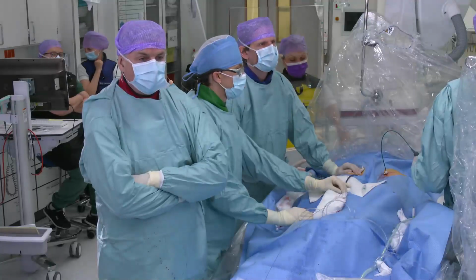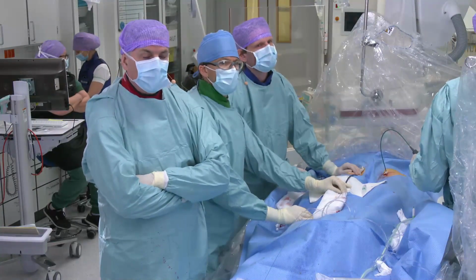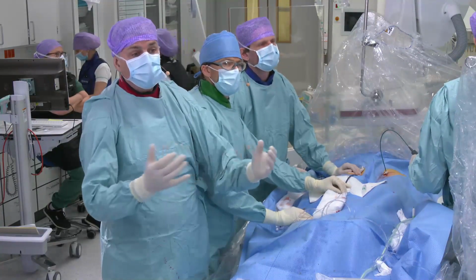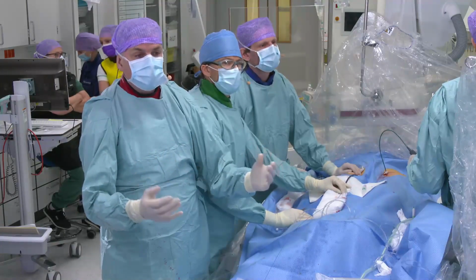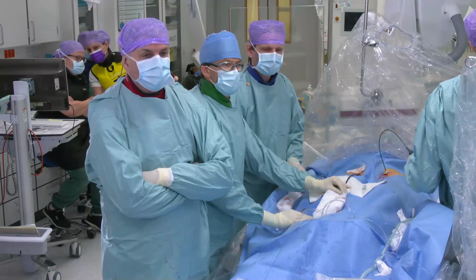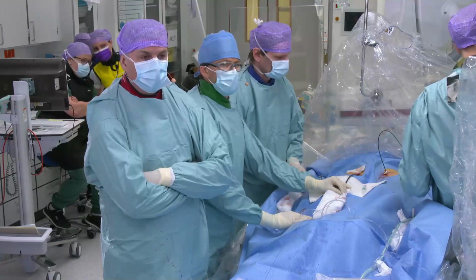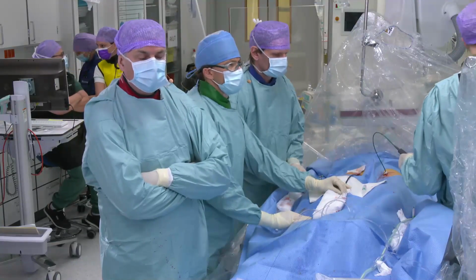Lars, respond before you leave us, Holger. Lars, what do you think about Holger's thoughts about this? I'm a bit surprised, because when you see a CT scan, you see how different the morphology is, and there are small side lobes and so on. You can miss those on the echocardiography. All of us who are doing TEE procedures would never do a procedure if you didn't have a CT scan before. So I think it's a small request to have a CT scan before, and it gives you so much information and will optimize your procedure.